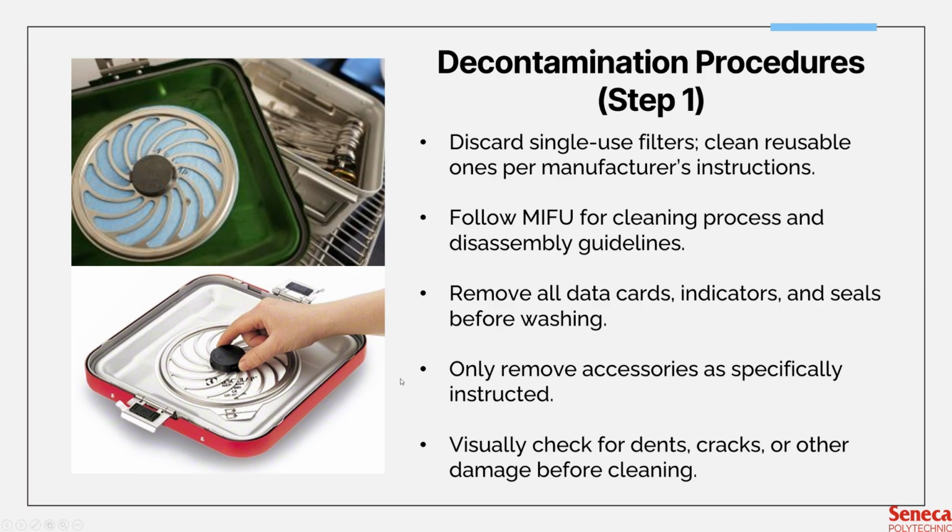Now we'll be looking at decontamination procedures. Step 1. Decontamination starts immediately after a container and its instrument set was used. We say immediately, but typically we allow at least 15 minutes for pre-cleaning before it's transported to decontam.